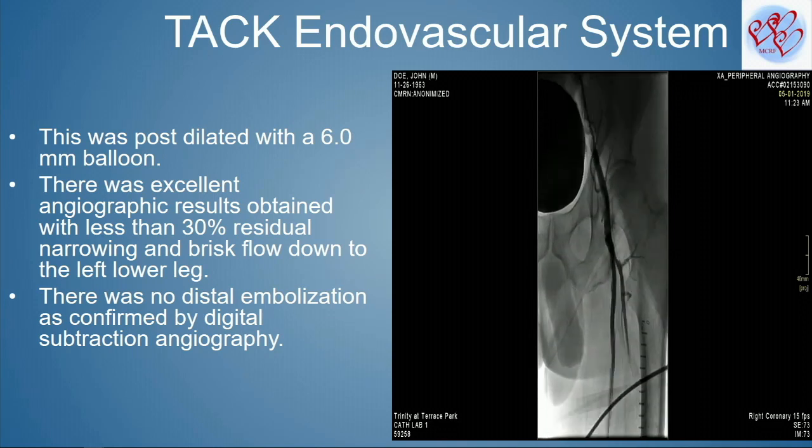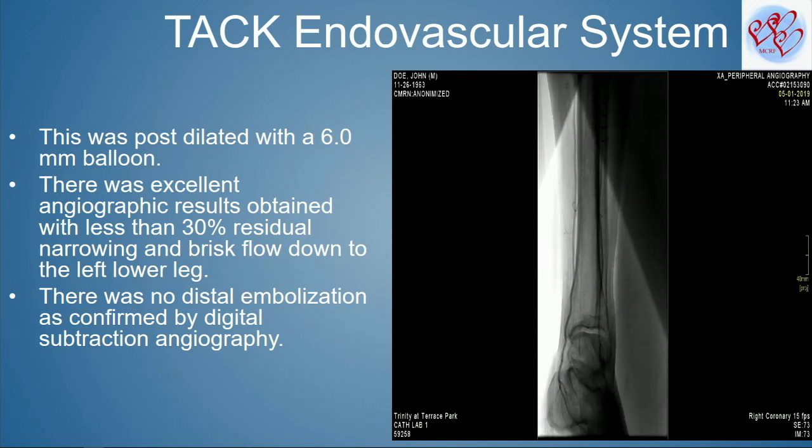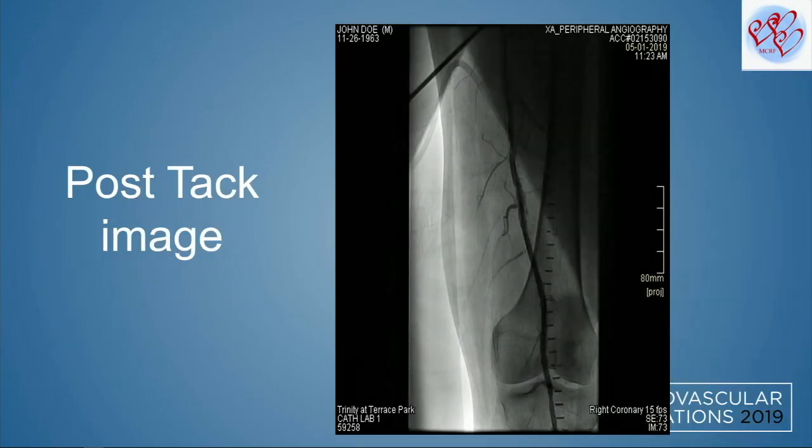So this is the final angiogram. We dilated post-TACK deployment. We used 6 tacks. We dilated with a 6 millimeter balloon. You can appreciate the good flow to the foot, 3 runoffs, no residual embolization distally, and the residual stenosis less than 30%.